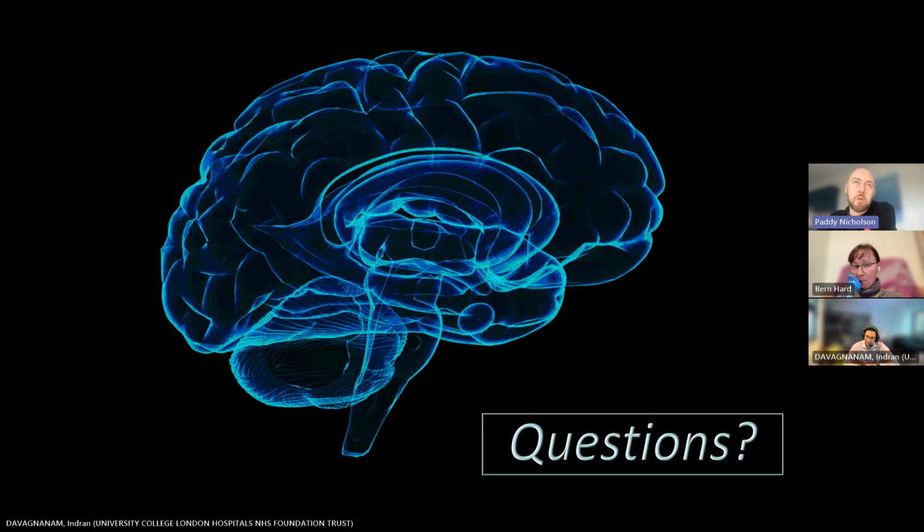And then if I'm unsure or stuck with the DSM, I will often bring the patient for usually a CT myelogram, and it's often a combination of the two. The theme of all my answers is that there's no one right answer for all of this stuff. We have to take an individual patient-centered approach. There's no one modality that will get you around it, so you have to use a combination of modalities depending on where the hardware is and so on.